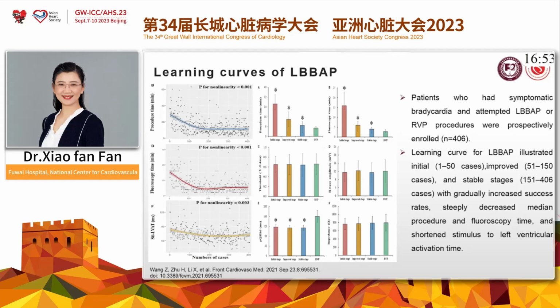Our team first started the learning curve of LBBAP. From this figure, we can see that with the increasing number of LBBAP cases, the procedure duration and the fluoroscopy time will be similar to RVP, and the pacing parameters are comparable with RVP.